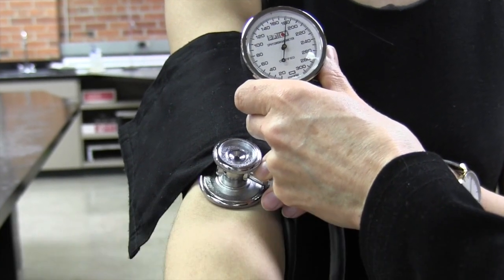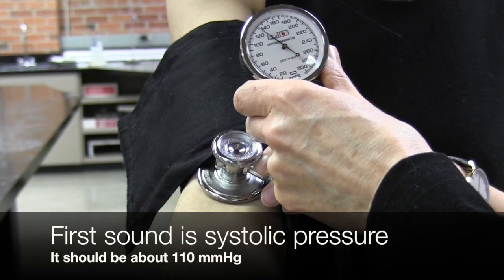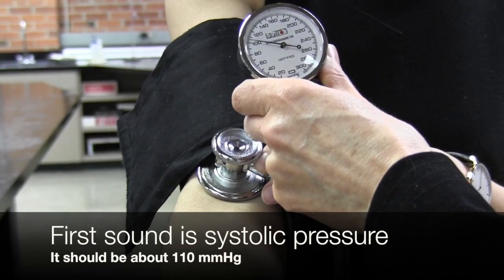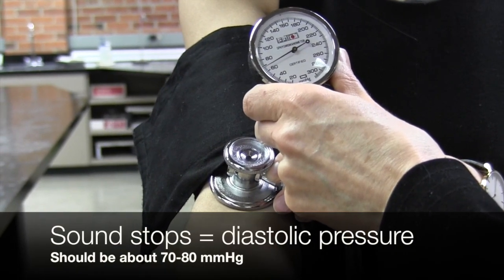We'll gradually let out the air, listening for sound as we do so. When we start to hear the sound, that's the systolic pressure, and when we stop hearing the sound, that's the diastolic pressure.